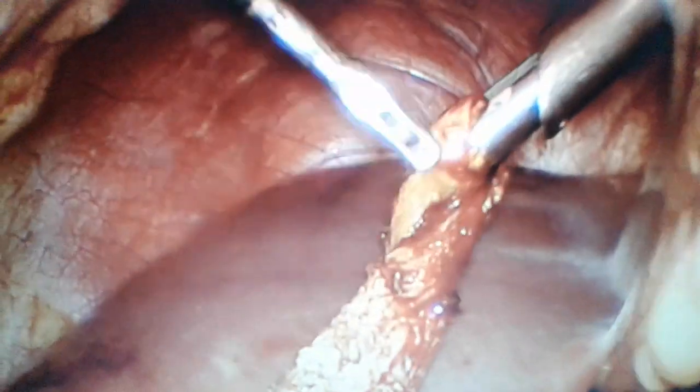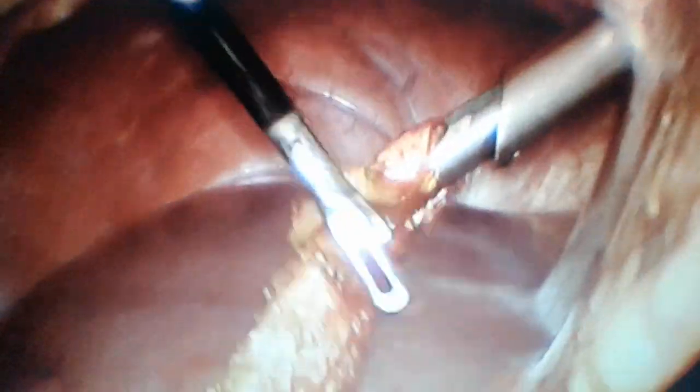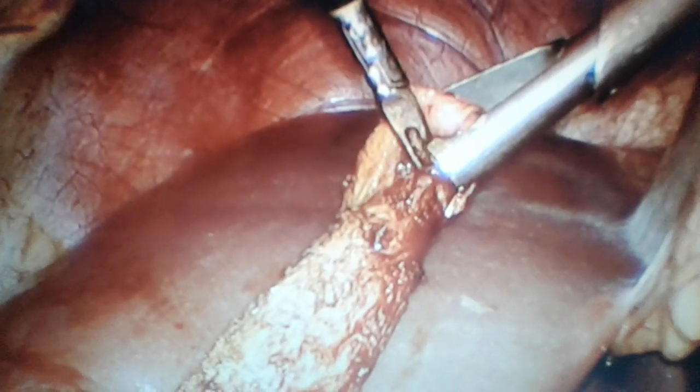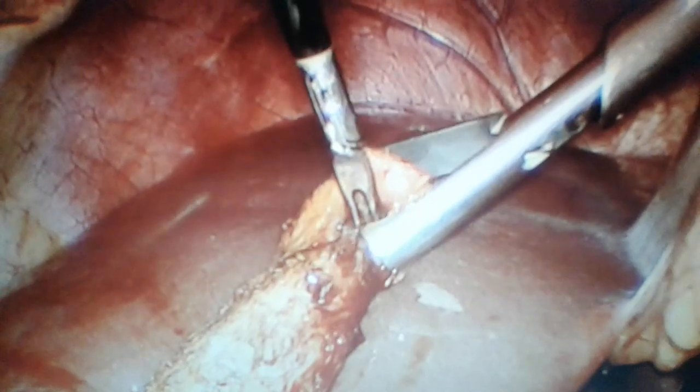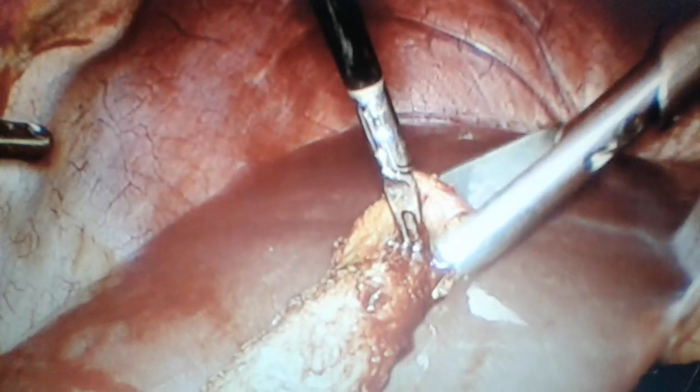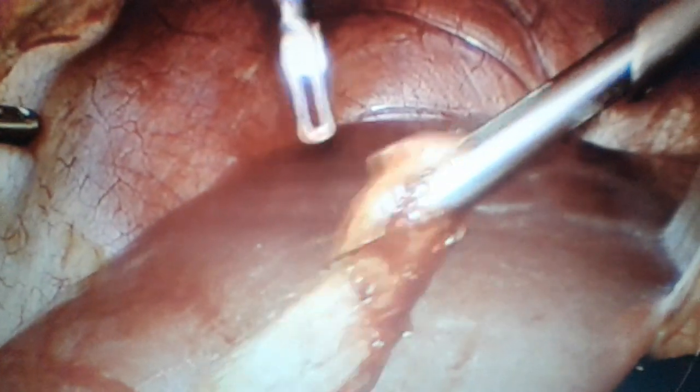So in order to get over it, what we can do is use this gallbladder as a natural endo bag. Avoid spillage of stones and content while removing the gallbladder through the epigastric port.